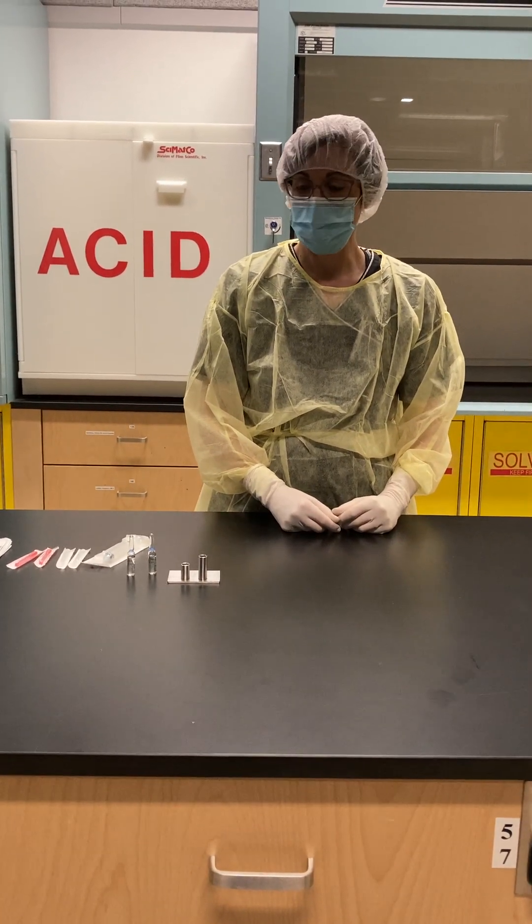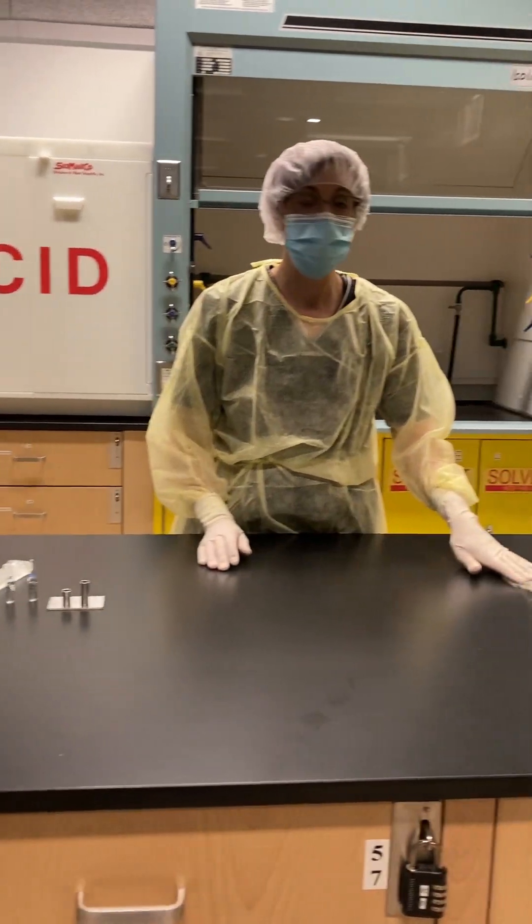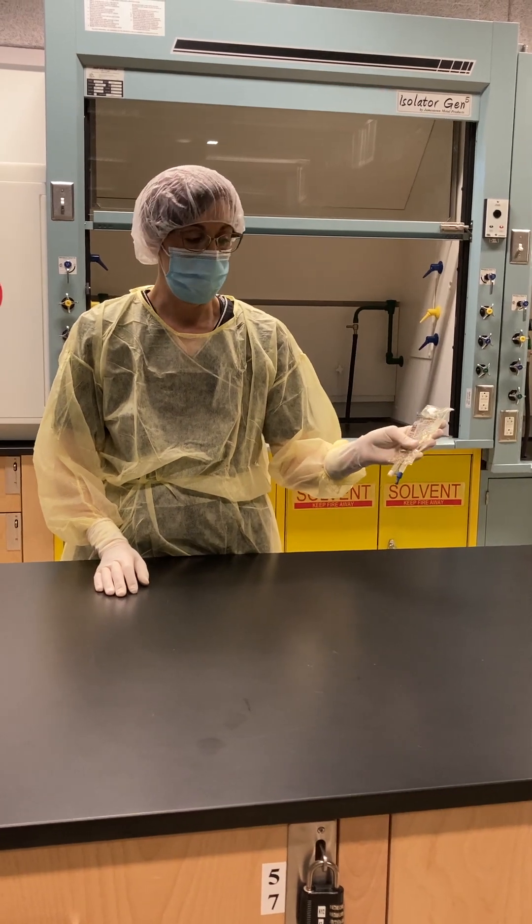For this lesson we are going to practice drawing off from an ampoule and then injecting into a 100 ml sodium chloride mini-bag.